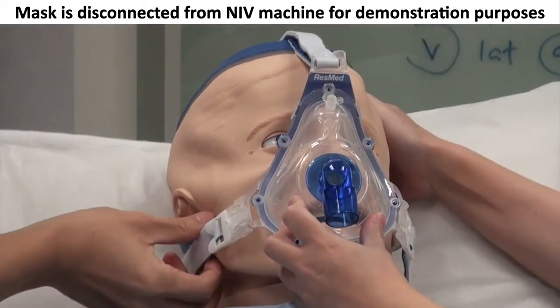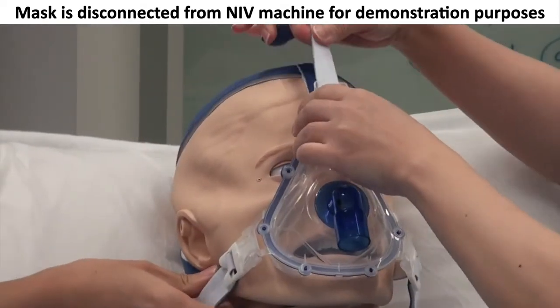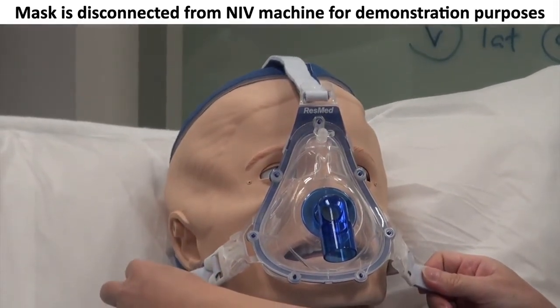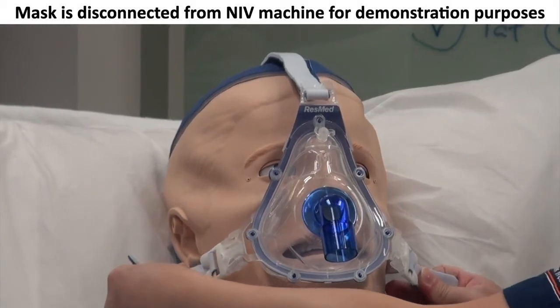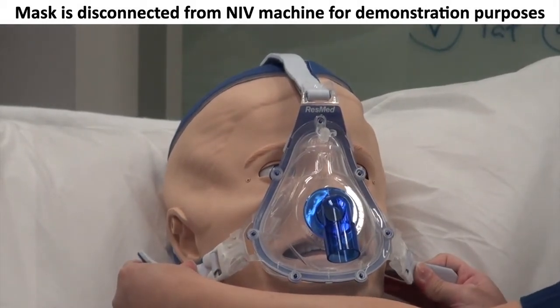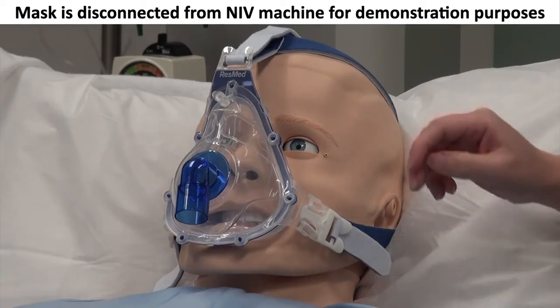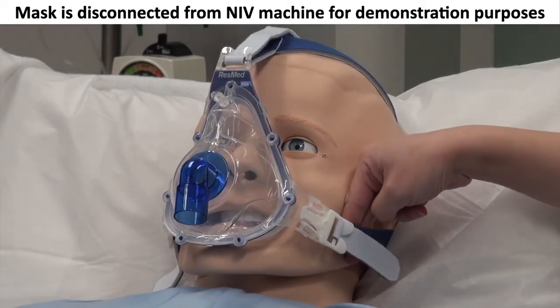Adjust appropriately. You can tighten the straps here and on the two sides. Always ensure that you tighten the two straps together so that it is not to one side. Ensure that the mask is not too tight on the patient's face by inserting 2 fingers between the strap and the face.